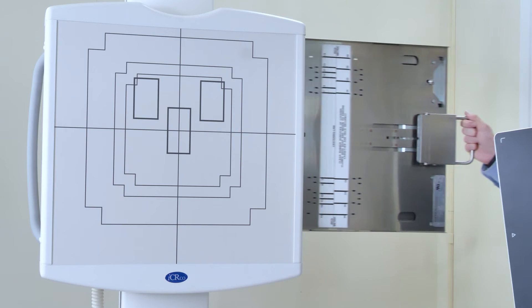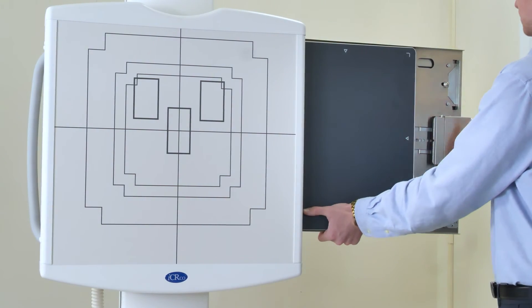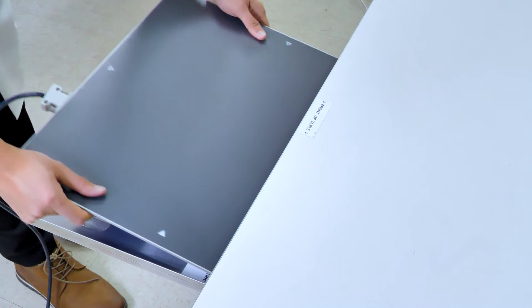The AirDRP has a retrofit capability that allows you to replace your cassette workflow without any adjustments to your table or bucky. It's plug and play.